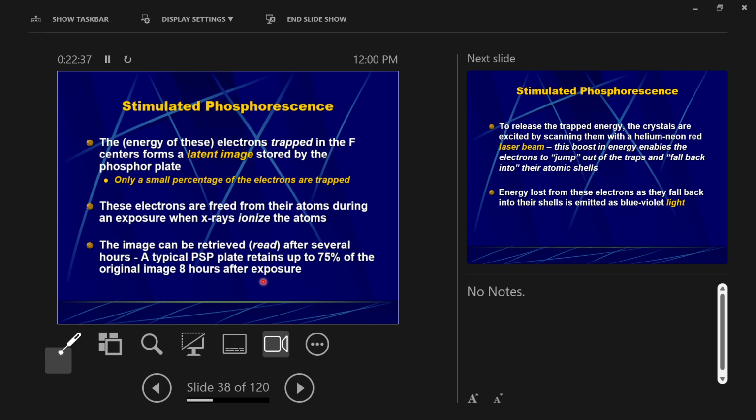And you had image plates like this, a bunch of them, and you had your X-ray machine cart, and you had to take a bunch of plates with you. You just remembered which one was which. So you put them in a stack. I'm not even kidding. It's a lot easier nowadays. But what if it was multiple different exams for each patient? So you put them in a stack, right? If you had to do chest, abdomen, and a shoulder, you put them in the stack in the order you wanted to do them, right? And then after you did them, you put them in exactly that same order, and you have to remember that order when you go to the processor.